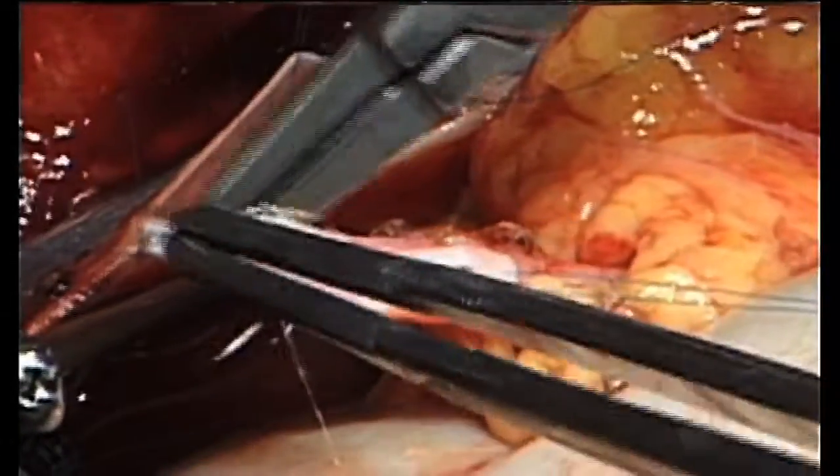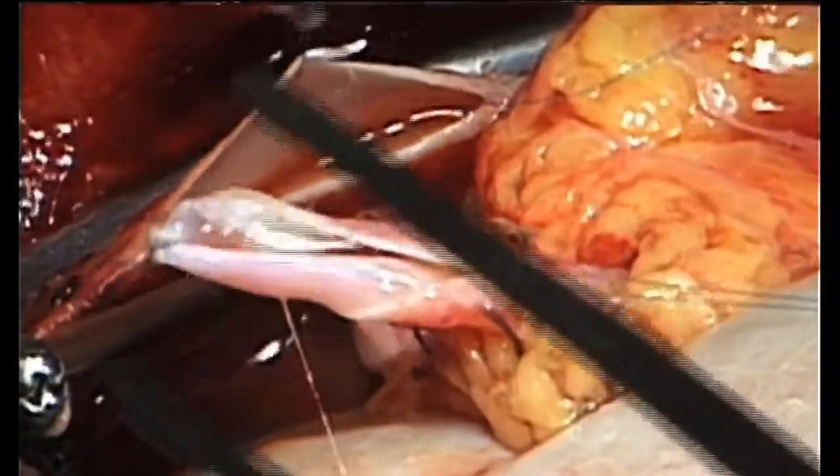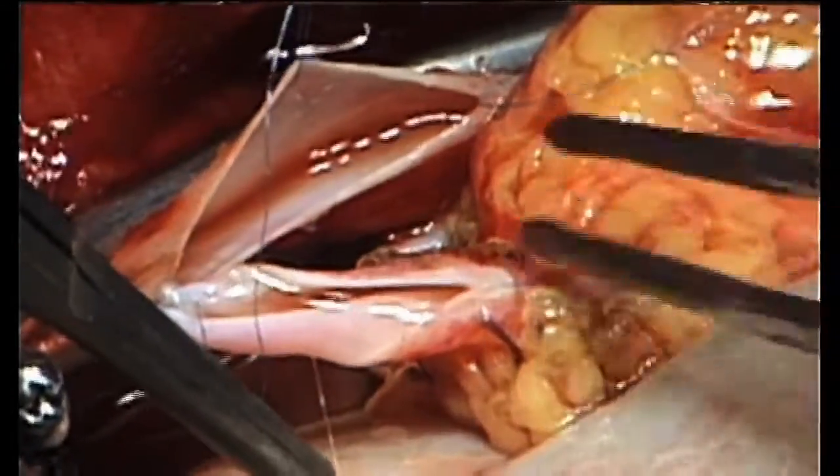The renal vein is anastomosed to the side of the vena cava by a running 7-0 proline suture.